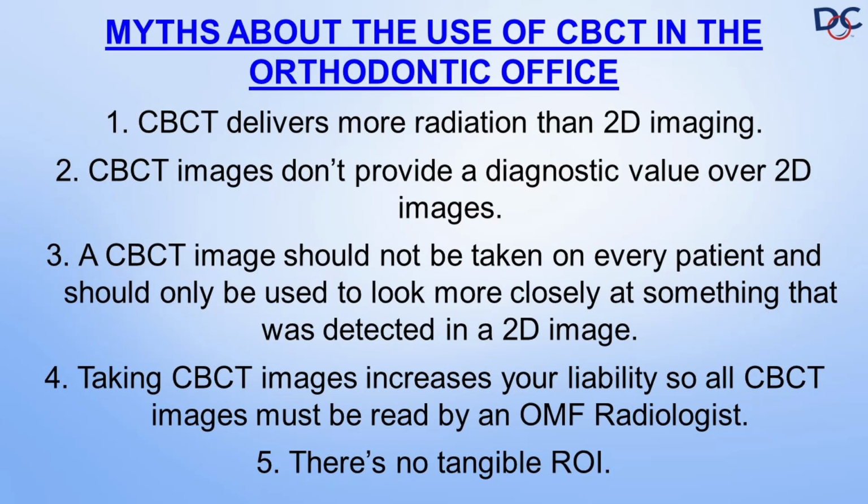Number 3, a CBCT image should not be taken on every patient and should only be used to look more closely at something that was detected in a 2D image. Number 4, taking CBCT images increases your liability, so all CBCT images must be read by an oral and maxillofacial radiologist. Number 5, there is no tangible ROI.